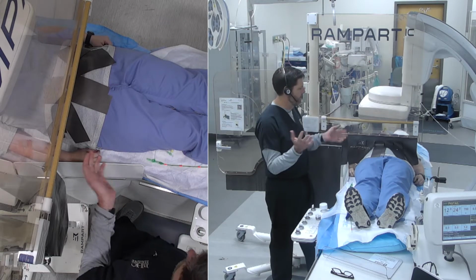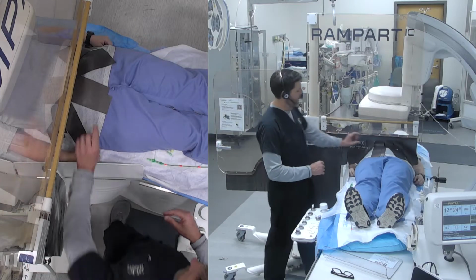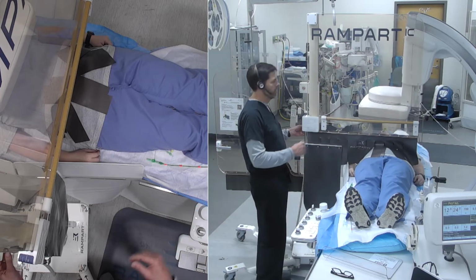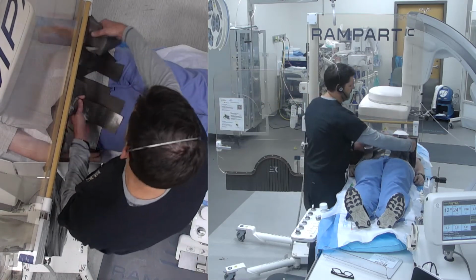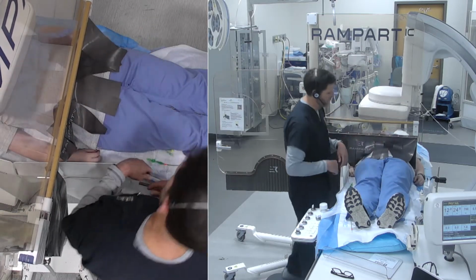First thing, most important thing is to make sure the Rampart is set up correctly. And again, you want the lower extremity panel to be across the patient. You want the soft portions of the accessory to be over the patient to prevent scatter.